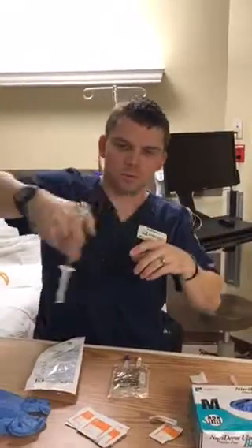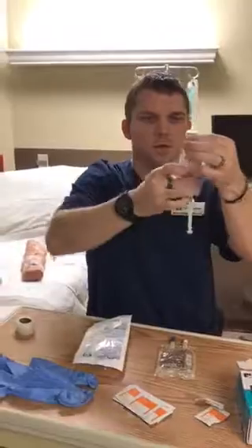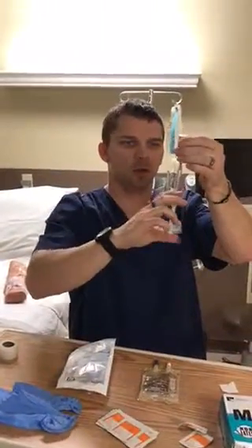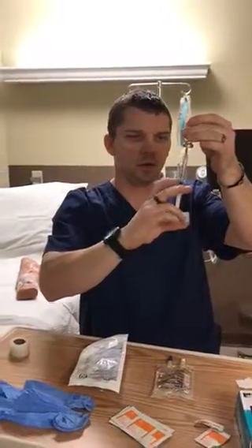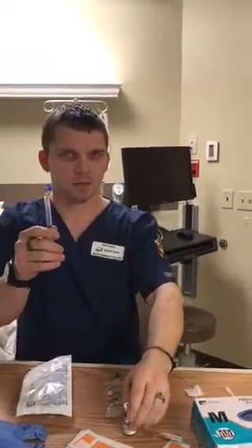I'm going to get any air up to the top of the syringe, and I'm going to instill that air in there. All right, 3 milliliters, like that. All right, I'm going to set that down there.